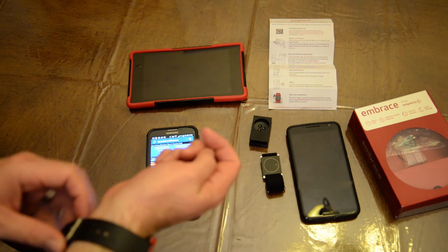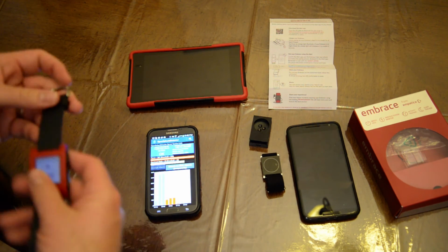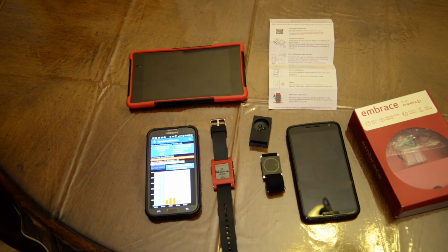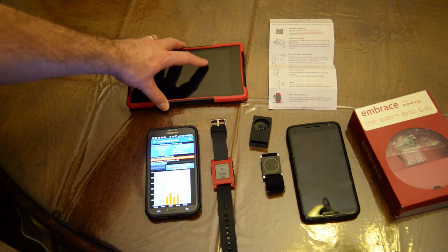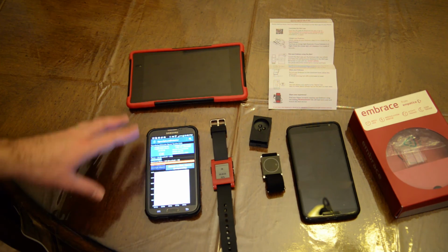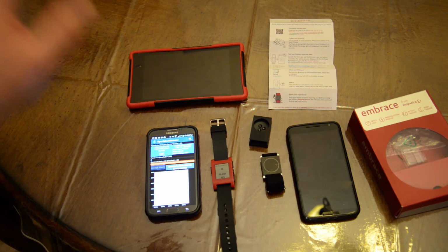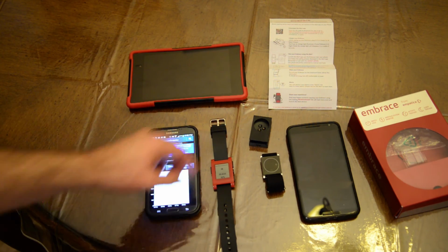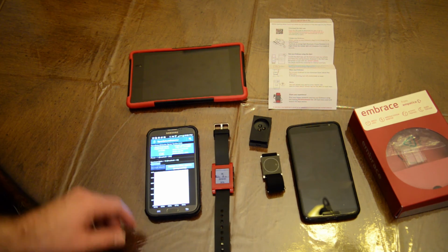Now in this case, we have this whole phone set up in my son's room, and we have a camera to where it has audio on our phone. So we do hear this play through our phone. You can also log into the app, and the app on the computer will definitely go off. It'll make a little beeping sound, but you can definitely monitor it that way. So this has the benefit to actually see the data going across so you could kind of determine if you really did have a seizure.